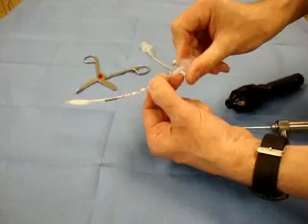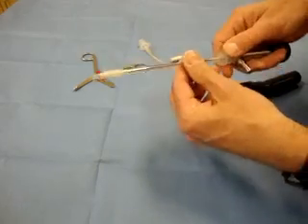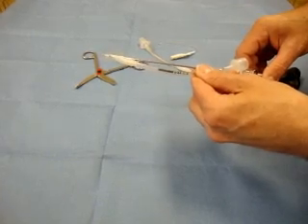Approximately that much of the tube. We will reattach the adapter, check our length, and then advance this on until we have our tube coming right to the tip of the endoscope.